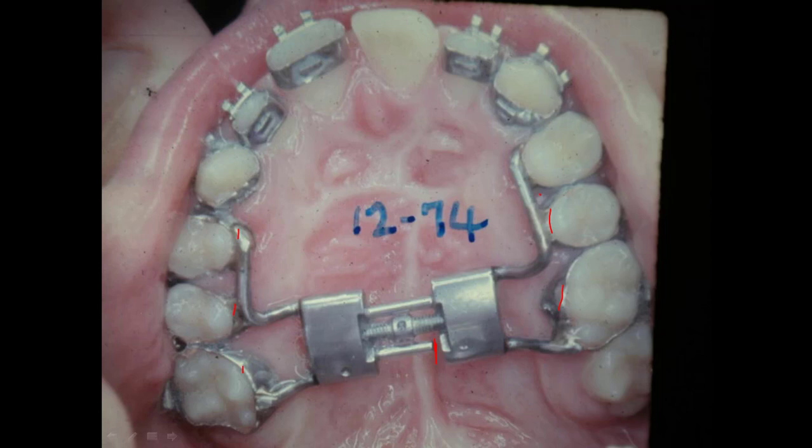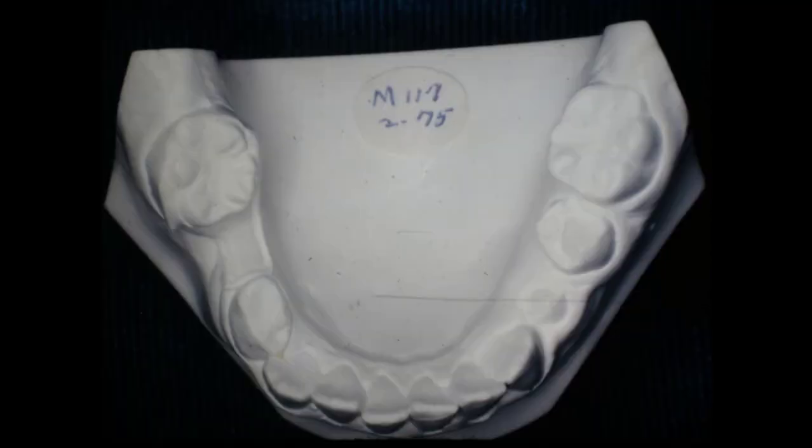Let me get over here to one of these pictures and show you where I had my little finger in the palate. And here we are — this was in 75.